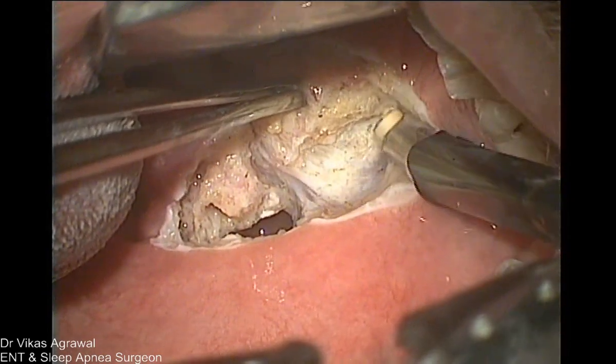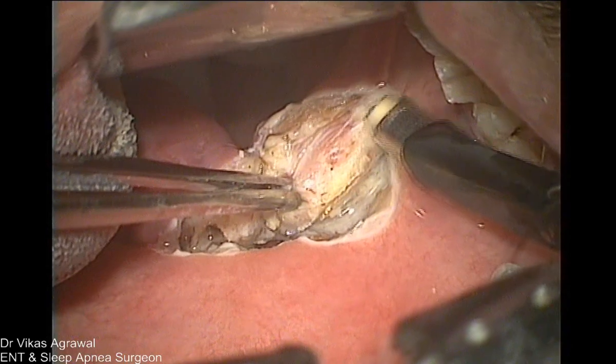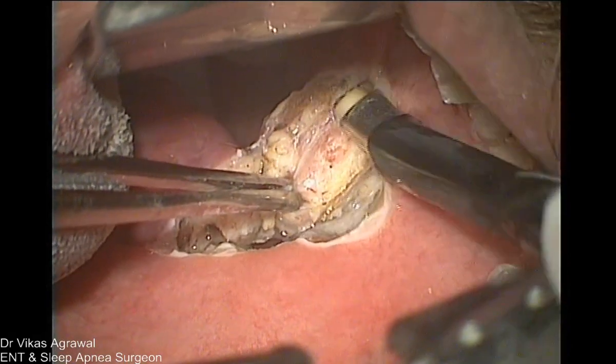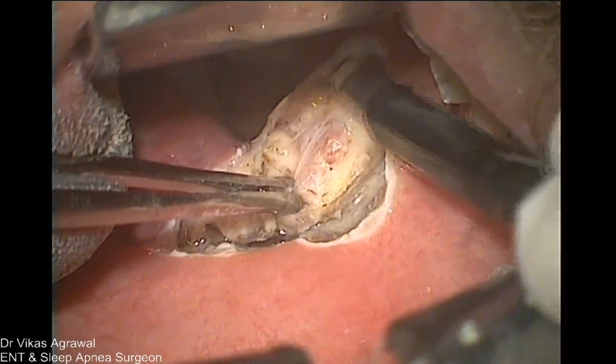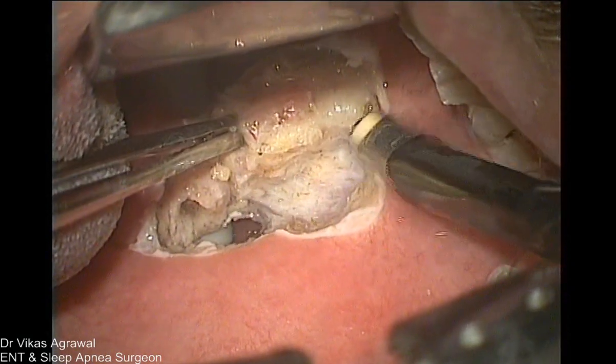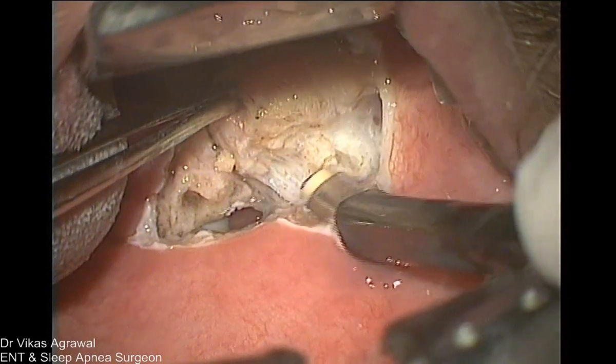So I'll be a little fast because we have already discussed everything. In the first surgery, I'll be a little fast in order to save time because we are already running late. Going laterally. There's a cotyledon of the tonsil here.